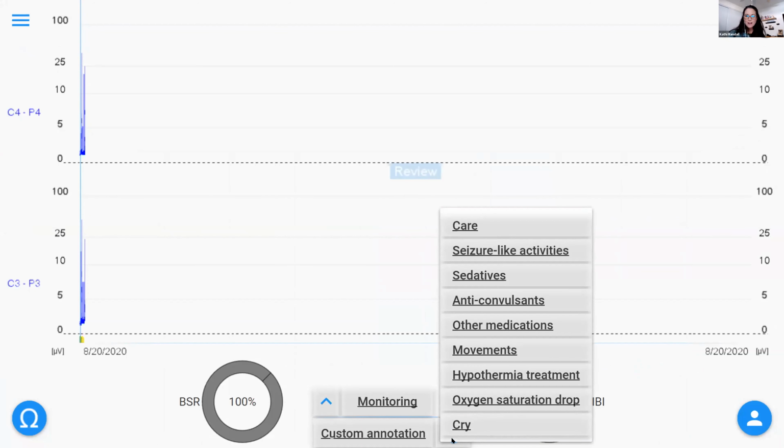So that was great. Let's see, is anyone using this now for daily monitoring? What changes are being made? Is this mainly a seizure differentiator versus normal behavior? Great question, Cheryl. So definitely in that list of patients that I gave you, some term baby conditions, some preterm baby conditions, there are many units around the US as well as in the world who have been using this as a daily tool.